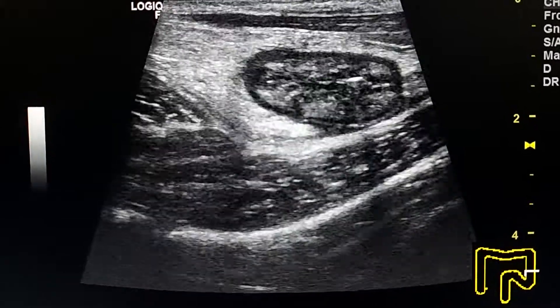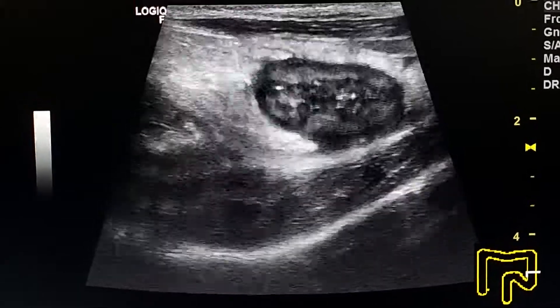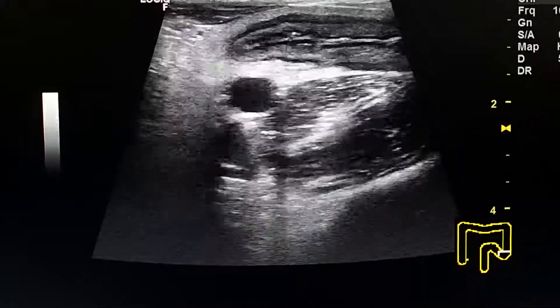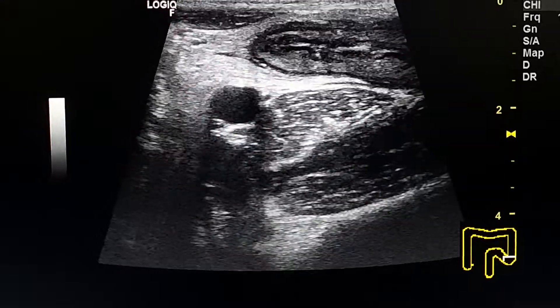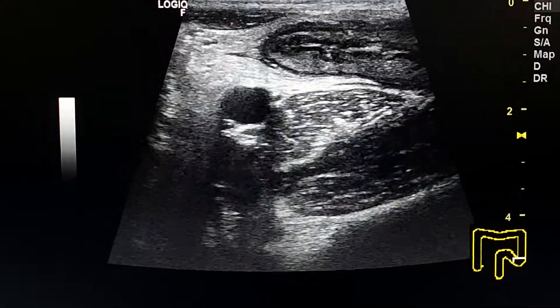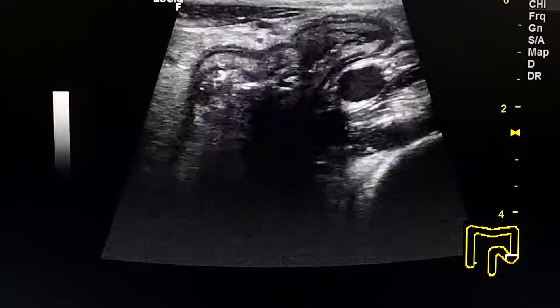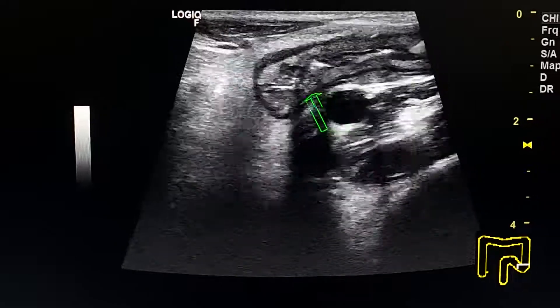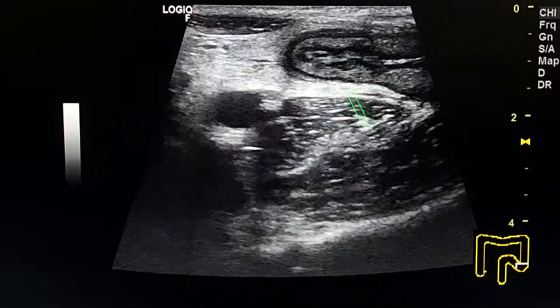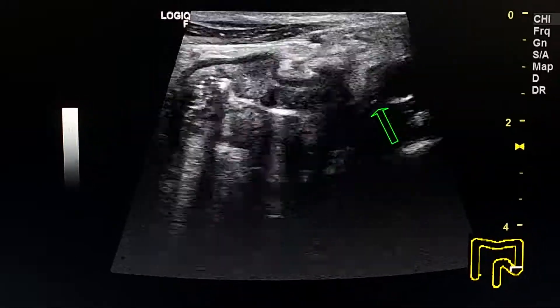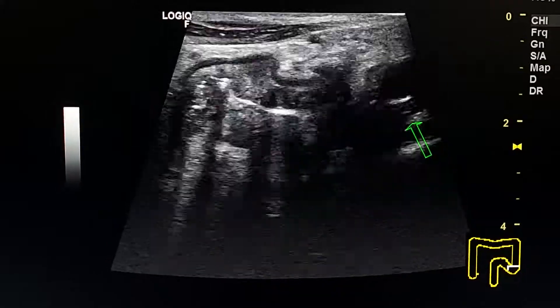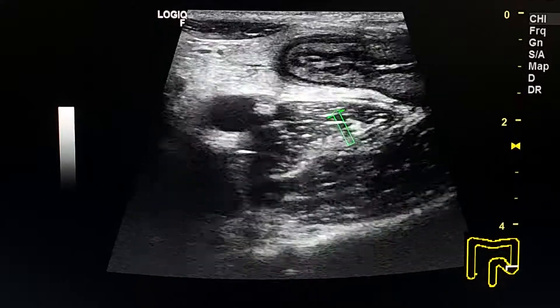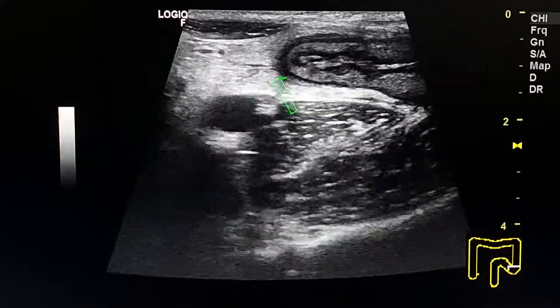Here we see the transverse colon and the descending colon while compressing it. Here is the beginning of the sigmoid colon. Here we see the colon crossing the left iliac vessels. This is the psoas muscle, and this is the colon.